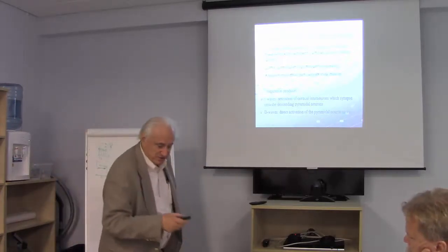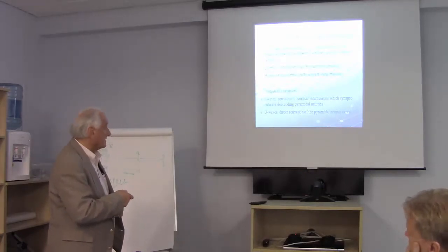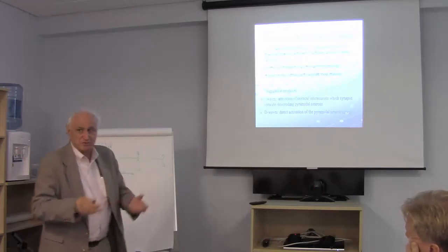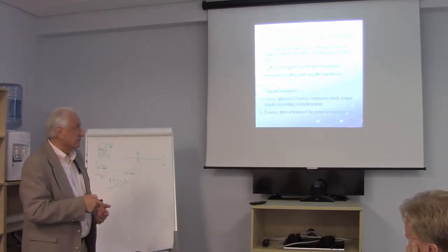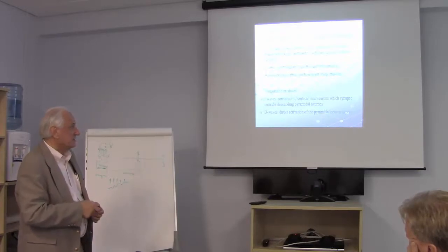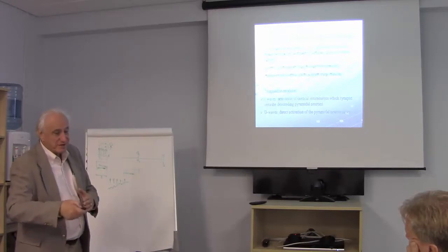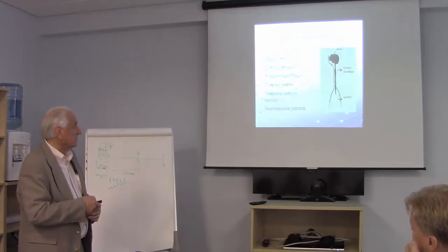So let's go back and start with the motor potentials. We've talked about the anatomy of the spinal cord and the fact that you have the dorsal column pathways, and the lateral corticospinal pathways are the ones that we're most interested in because they activate the limb muscles. The kinds of things we can measure are the I waves and the D waves, and we'll look at those. The effect of the I waves, or primarily the I waves, is to produce these compound muscle potentials, which is what we normally record.